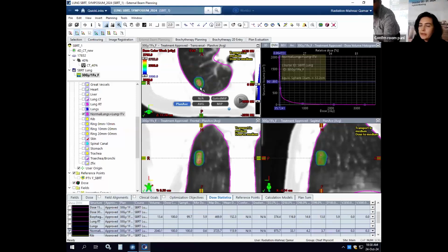So when we do a 4D CT, it takes 10 phases. Then we determine in which phase the movement of the tumor from the median phase is less than 5 millimeter, like I showed earlier. So that's basically our criteria. In some cases, if the duty cycle of the curve is very low, even though we're sparing the lung, it actually increases the treatment time.